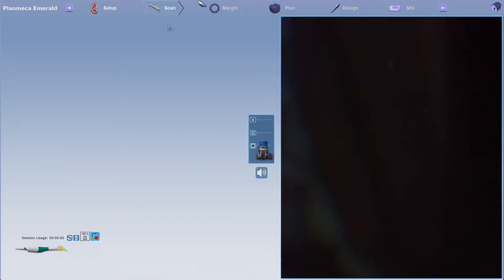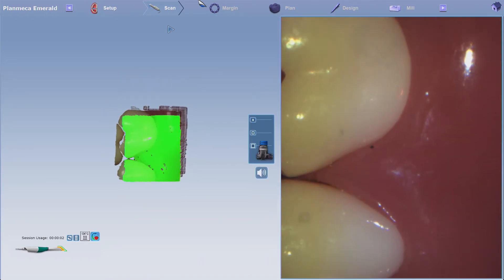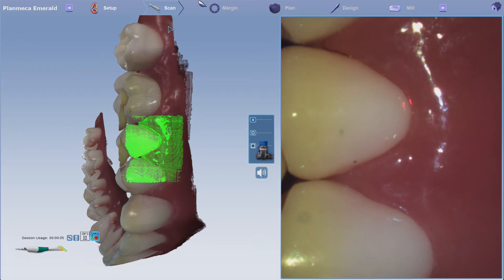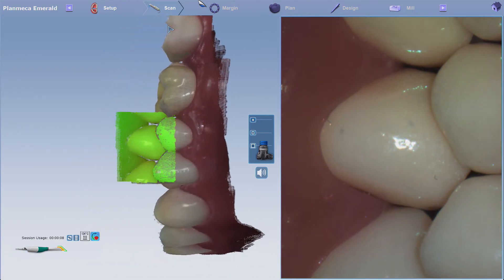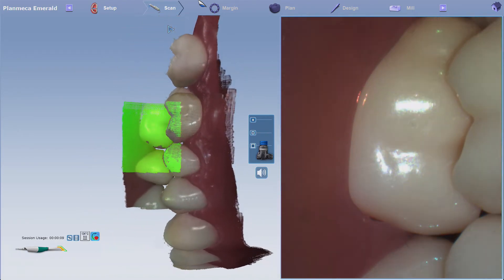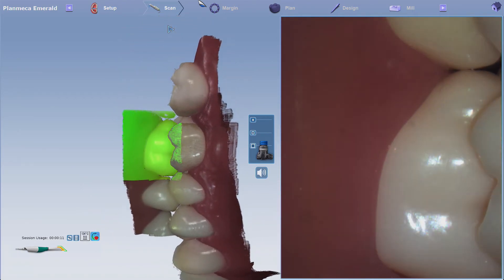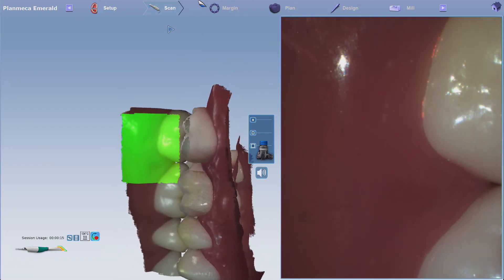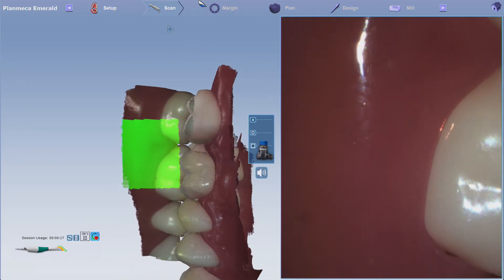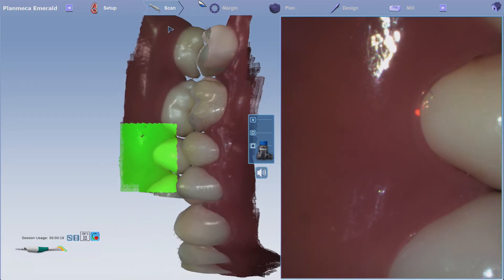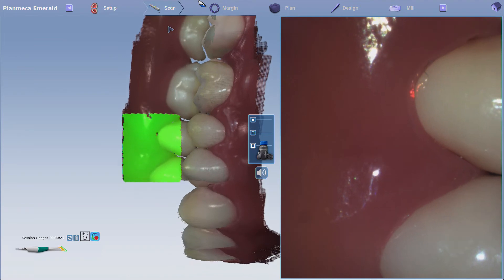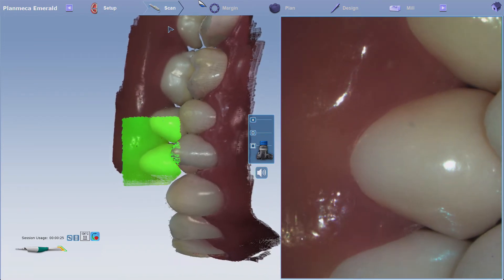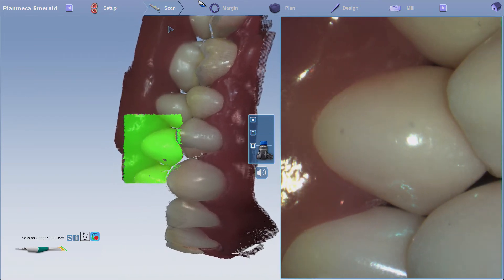Scanning the buccal bite is the same as restorative. After you start scanning, focus on one arch until the model flies in, then go to the opposing arch and scan that area until the model flies in. If the models don't appear, stop scanning and manually align them in the Bite Alignment tool.